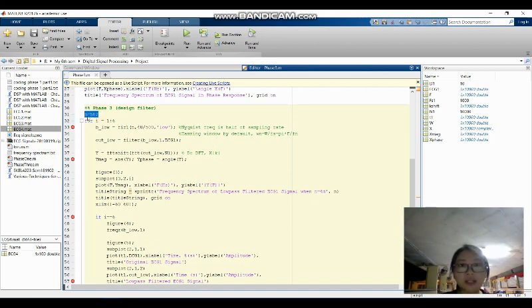First, we initialize the filter order equals 58, and by using the for loop we vary the filter order from 58 until 158. Then we use the FIR1 function to do the FIR design using a window method. The input is filter order, frequency constraint, and also the filter type. The filter order varies from 58 until 158 as mentioned before, and the frequency constraint is equal to the cutoff frequency divided by sampling frequency, which results in 40 divided by 500. 40 is used because the noise frequency is at 50, so we put 40 Hz as the cutoff frequency, and the filter is a low pass filter.